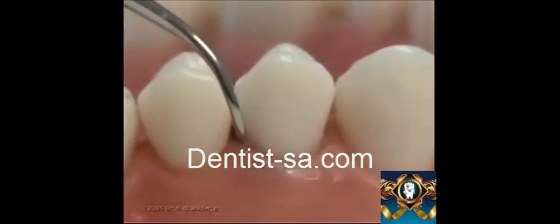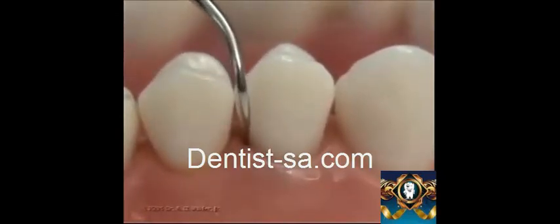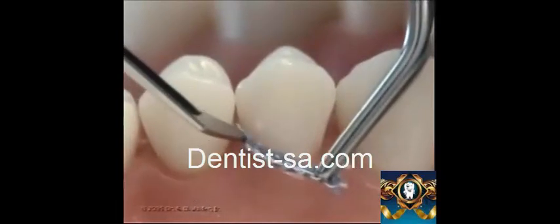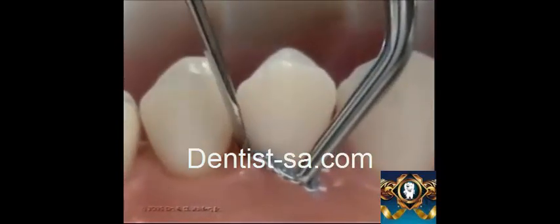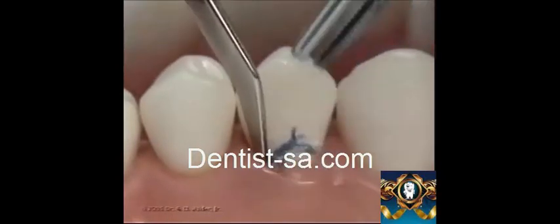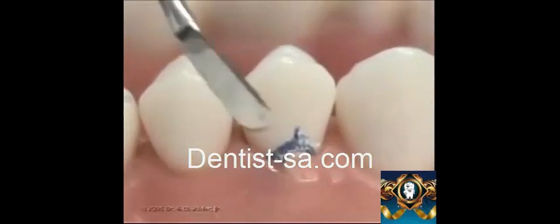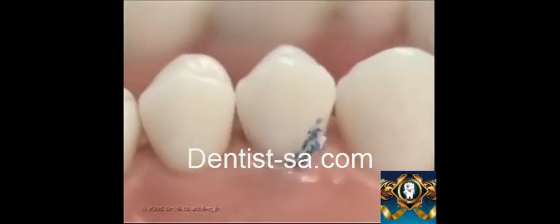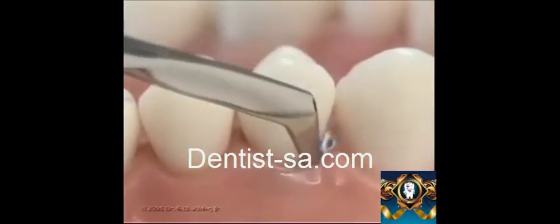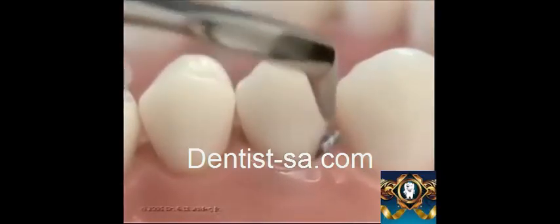The retraction cord could also be placed with a cord packer rather than an explorer. Retraction cord achieves two things: one, retraction of the gingiva, and second, hemostasis of the gingiva. Here the retraction cord is now being placed with a blunt instrument like a cord packer. As explained earlier, the retraction cord should be completely immersed into the gingival sulcus in all the areas, both facially and lingually.